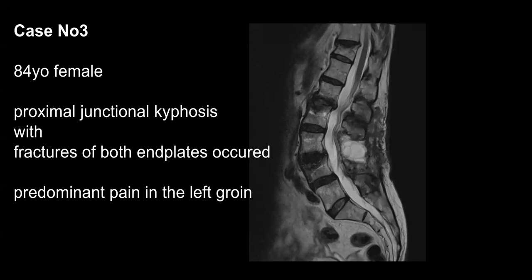We were discussing a stimulator, but if you've got an ongoing compression, these stimulators don't work very well. They work for a couple of weeks and then the pain comes back because the compression of the nerve root, this intraforaminal compression, is not solved. And now I want to show you what I did.